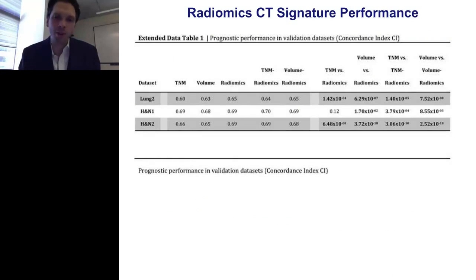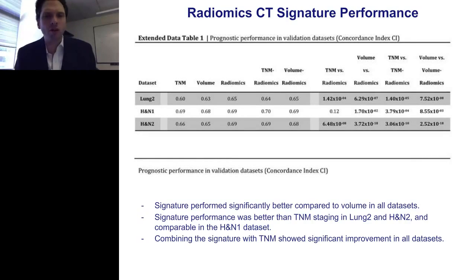Also, we compared this radiomic signature to different clinical parameters, and we found that the signature performed significantly better compared to volume. So, we could extract more phenotypic information than just simple volume. This is always our baseline that we have to assess.